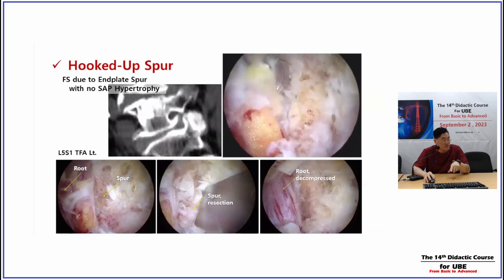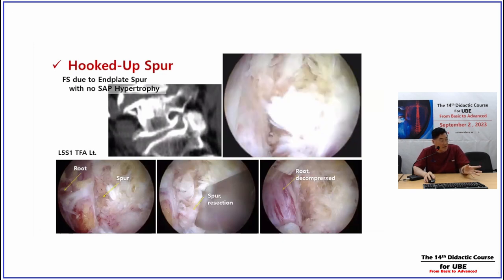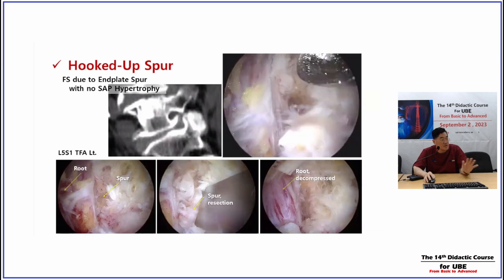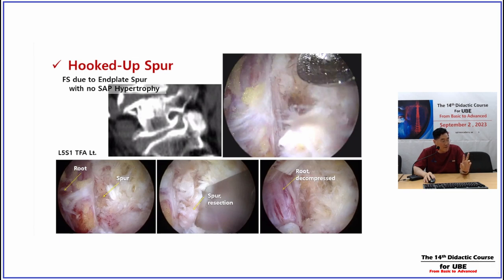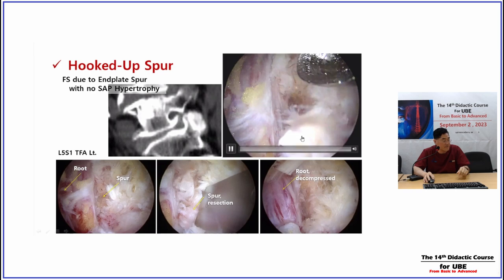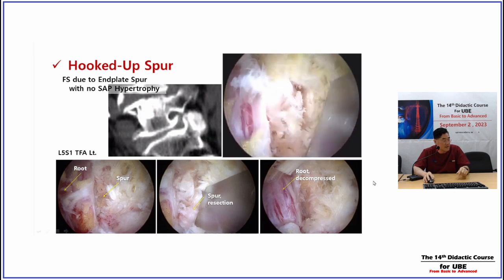When we perform the transforaminal approach we can inspect and decompress the nerve root. However, the ventral half is still squeezed and is easily neglected even during surgery. So when CT shows a transverse-long spur with foraminal height less than 7mm or a hooked-up portion, we definitely should decompress the ventral half of the nerve root. That is the significance of the end plate spur.